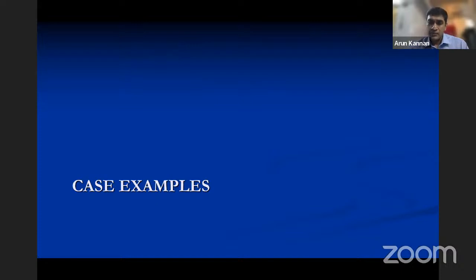definitely more than that. There have been a few cases where I have converted to a cemented stem because the femur was retroverted, so it doesn't allow you to go from retroversion to antiversion with the cementless component. There have been two cases where I used a cemented stem intraoperatively just so that I could change the version. There have been two cases where I had the pre-plan, so I was able to get the diaphyseal fixation bone Wagner stem to change the version.